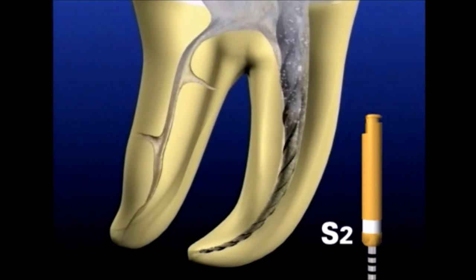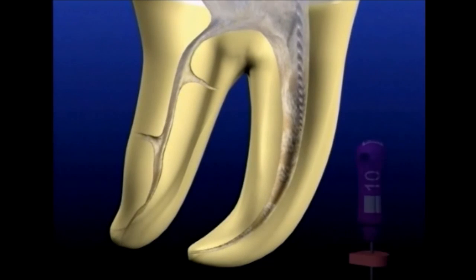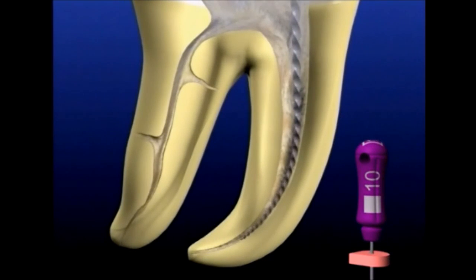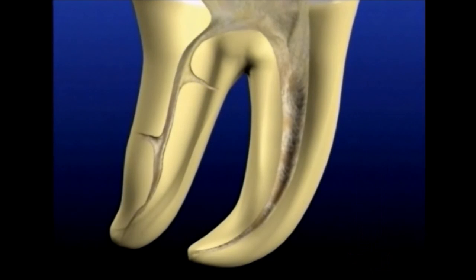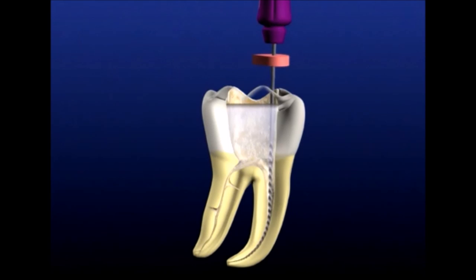When the instrument arrives at length, immediately withdraw the instrument as the shape has been cut. Following its use, we need to irrigate, recapitulate, and re-irrigate. Following the use of our first two shapers to length, it is wise to recall that working length will decrease as we've created a more direct path to the radiographic terminus. It would be wise then to reconfirm working length prior to finishing the root canal space.